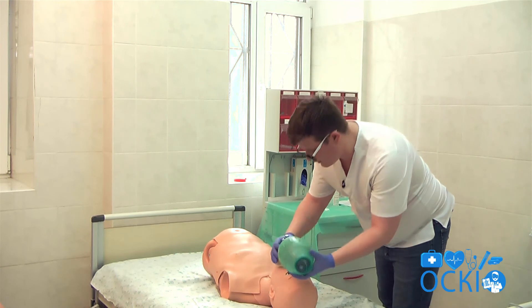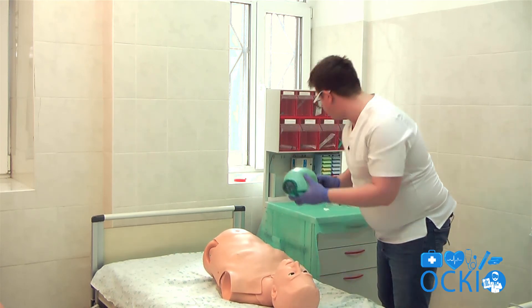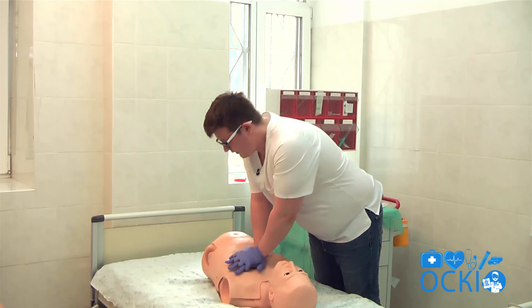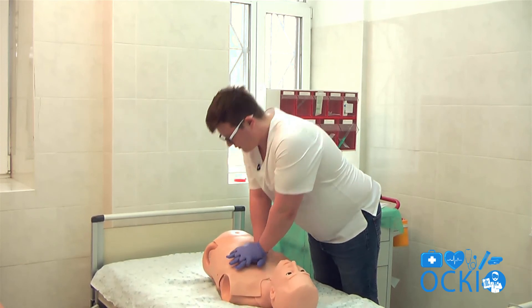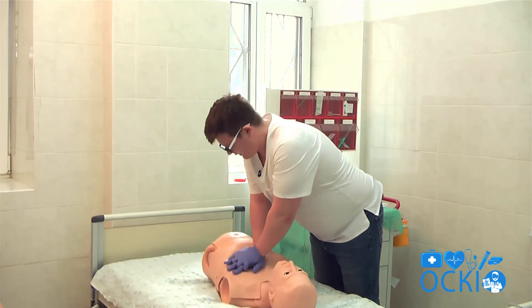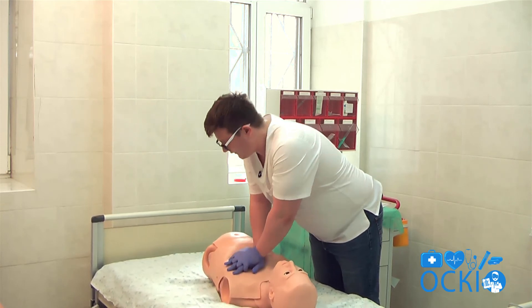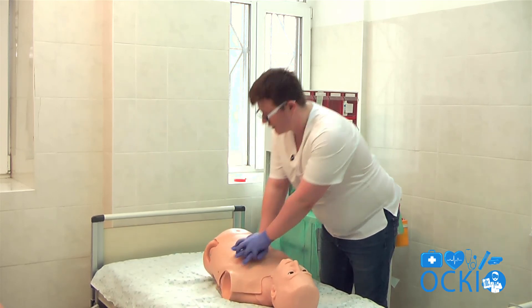Perform two breaths, then instruct the nurse to administer 300 milligrams of amiodarone after the third unsuccessful defibrillation attempt, and an additional 150 milligrams of amiodarone after the fifth inadequate defibrillation attempt.